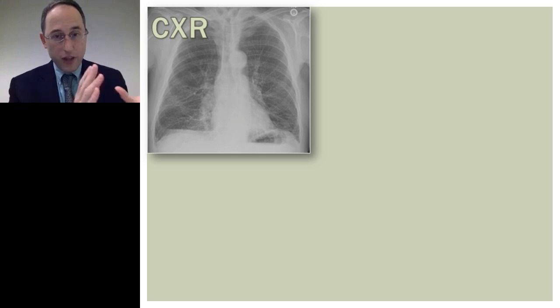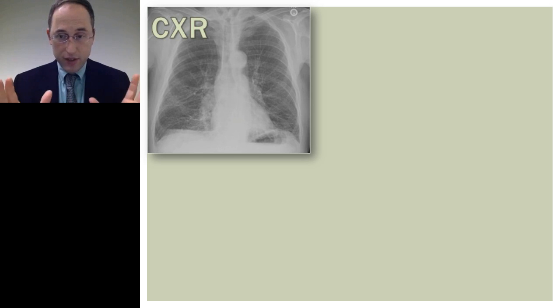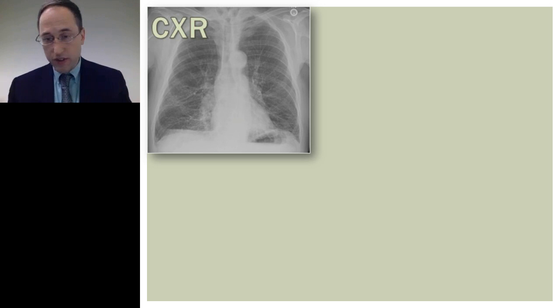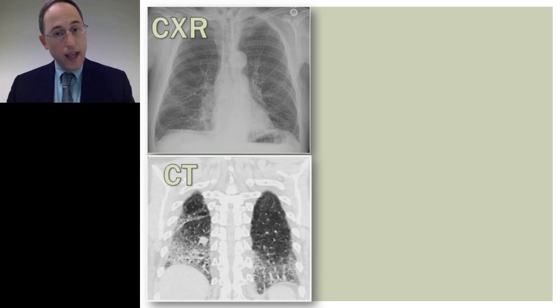All right, so we have a chest x-ray in the upper left-hand corner. A lot of detail there, but notice how you see the front ribs and the back ribs all in the same image. Heart, everything is there. It's as if you're looking through the person like they were an opaque piece of glass. Compare that to a CT image in the same plane, a coronal plane, and you have eliminated all of the anatomy in front of and behind the slice.